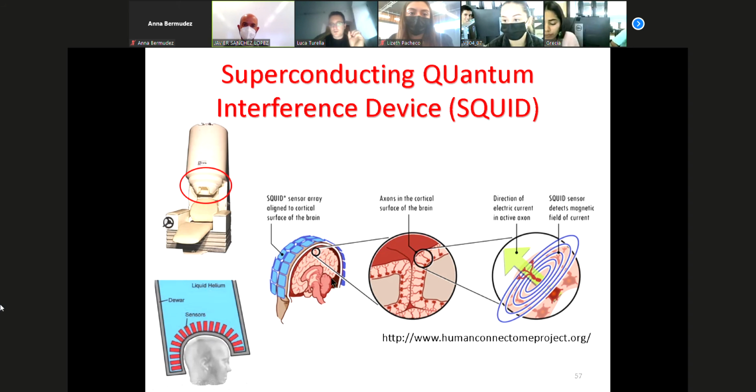Okay, thank you. And this is the only danger you have in the MEG: the liquid helium. It never happens, but potentially, if the dewar breaks, then the liquid helium will come into the MEG lab and pass from the liquid to the gaseous form, which is at normal ambient temperature, and this might pose a problem because it will expand. Normally, this doesn't happen, because this is why the dewar is constructed.